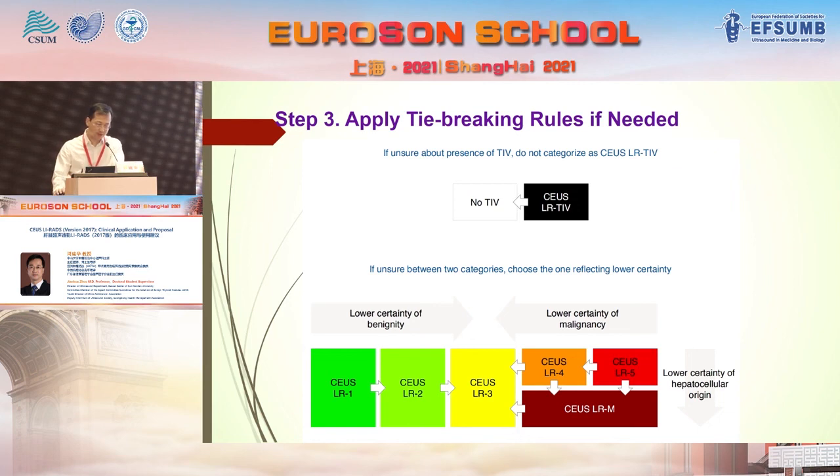So step 3 is to use the LI-RADS according to the certainty of the imaging features.